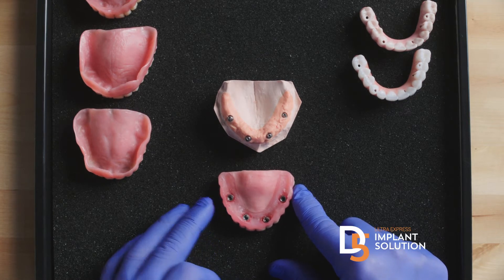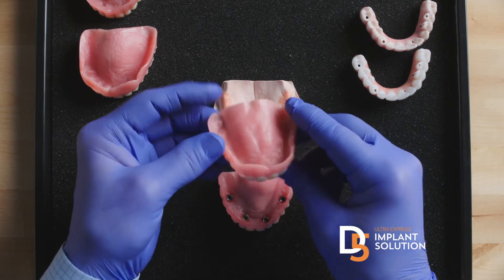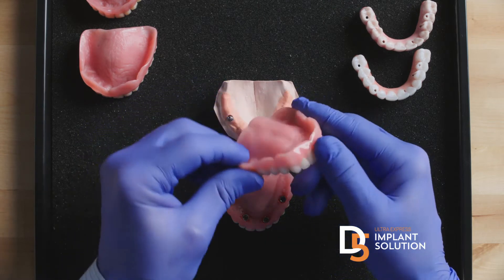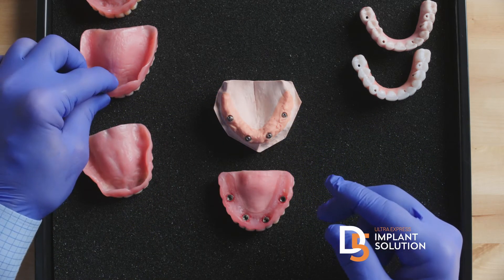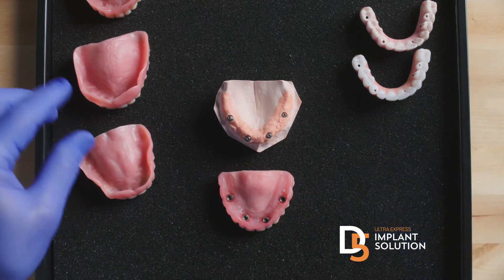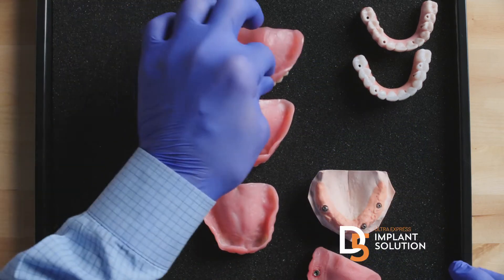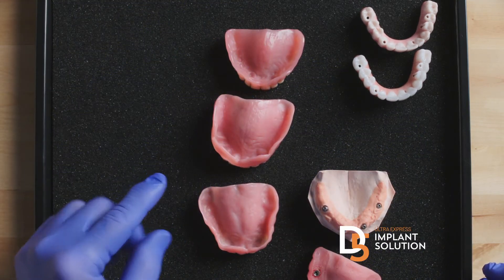What happens is the office will make an inexpensive plastic denture before the surgery. With newer technology, you can actually 3D print a denture or mill a denture, but if you look, they basically all have the same attributes — they're bulky, you have the palate, and they're weak.